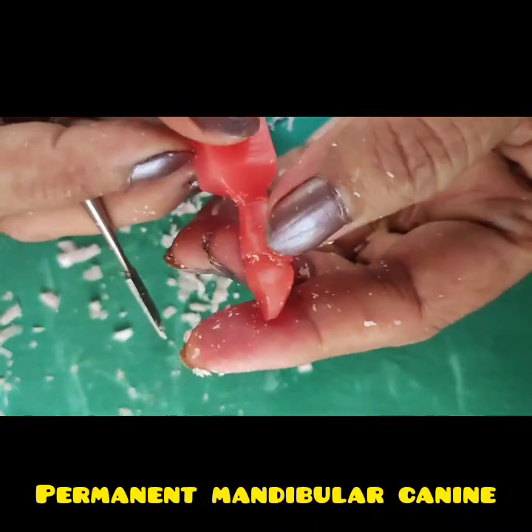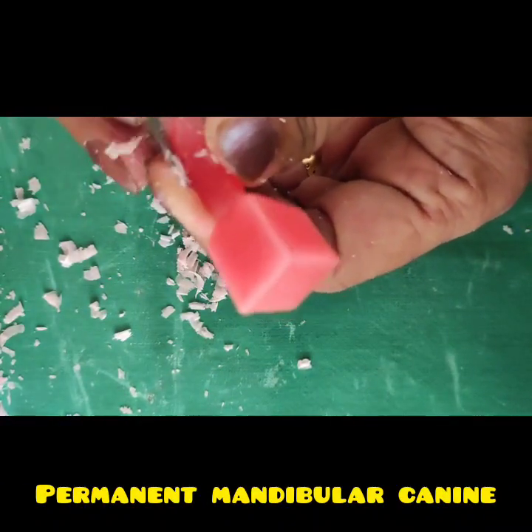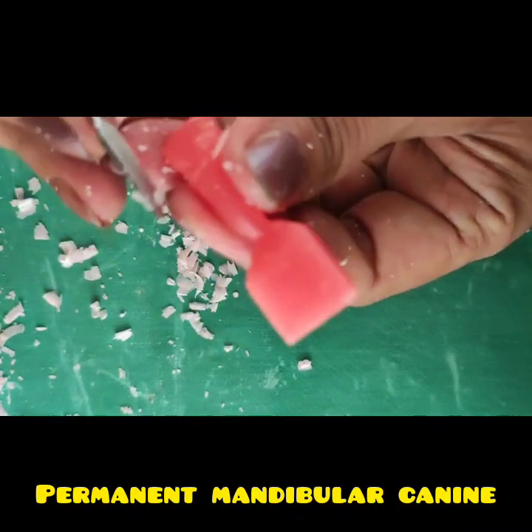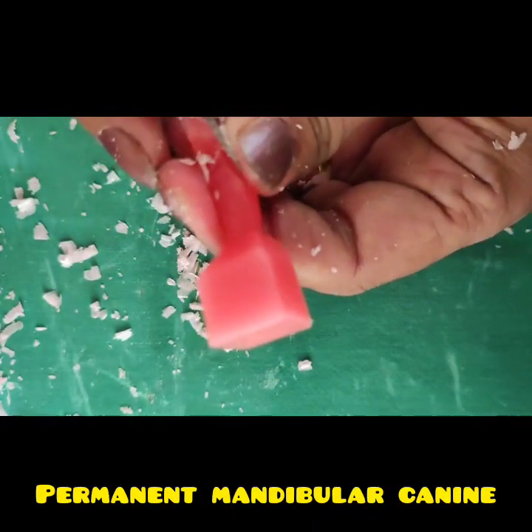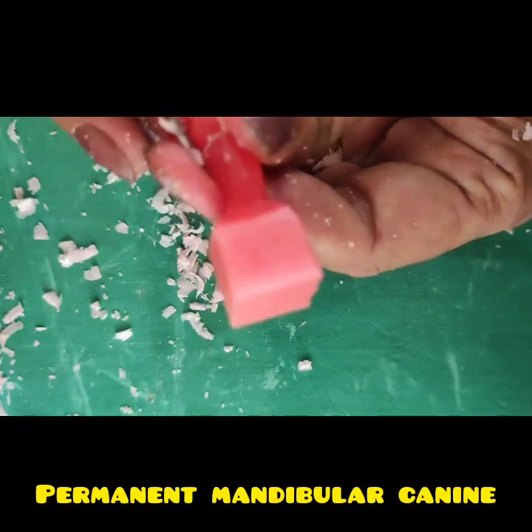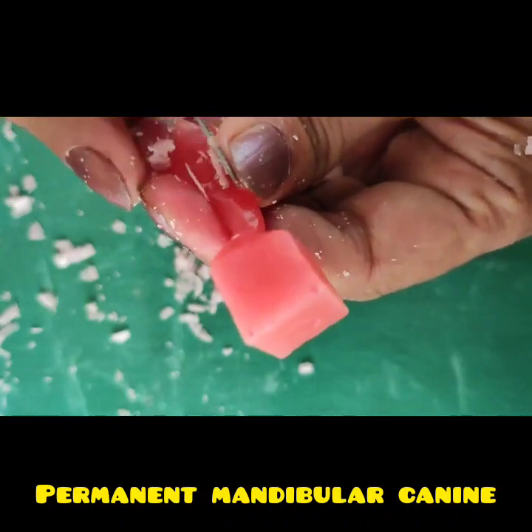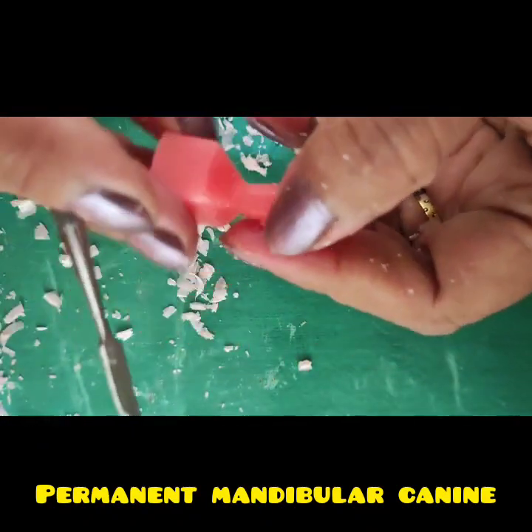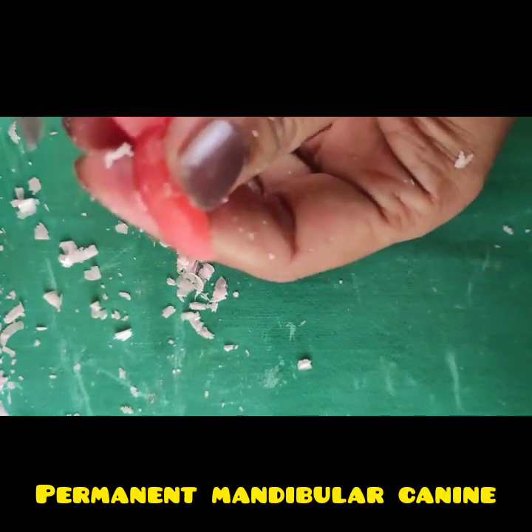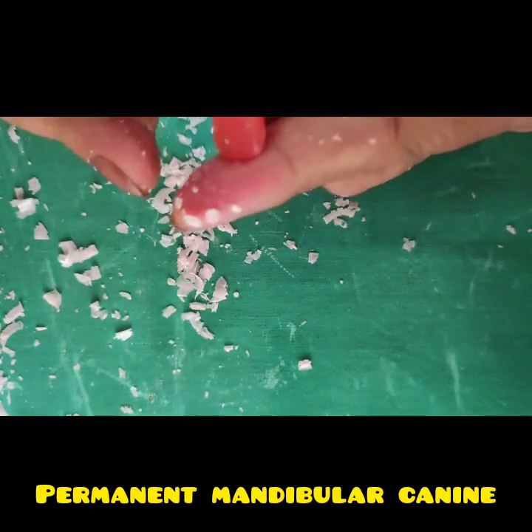Now after giving that, you can see there is a step of wax, so reduce that and merge the crown surface with the root surface so that both are in the same plane. There is no step and ridge at the cervical line.